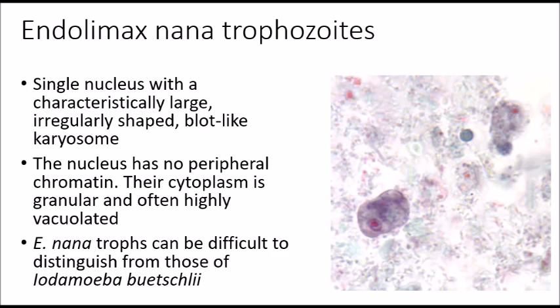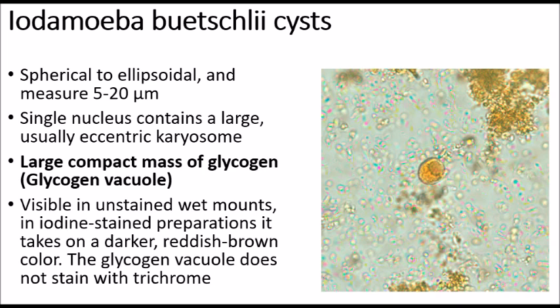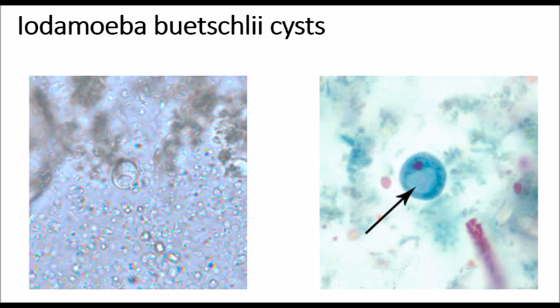Iotamoeba bushleyi: the cysts are spherical and measure about 5 to 20 microns. It has a single nucleus containing a large, usually eccentric karyosome. The key characteristic is a large, compact, massive glycogen vacuole. In an unstained wet mount it's still visible. In an iodine stain preparation it takes on a darker reddish-brown color; however, the glycogen vacuole does not stain with a trichrome stain. On the left you can see the cyst in an unstained wet mount with the glycogen vacuole clearly visible, and on the right is a trichrome-stained cyst where the glycogen vacuole does not stain at all.